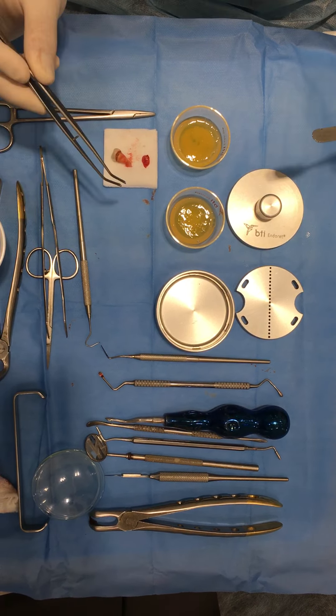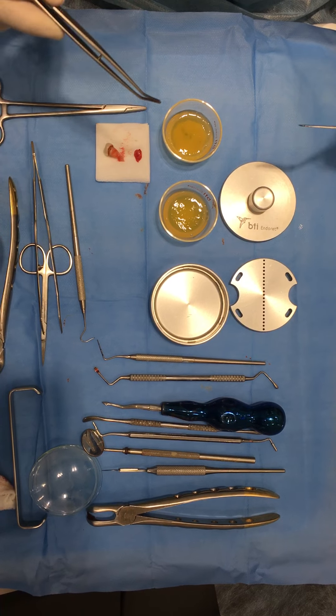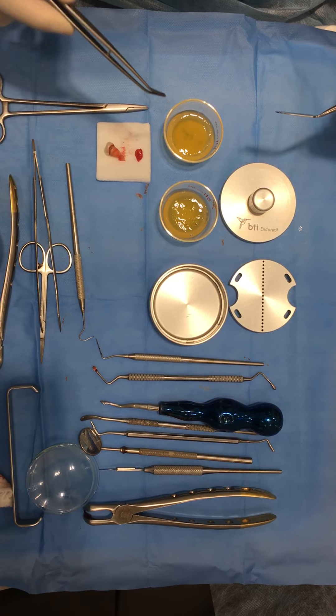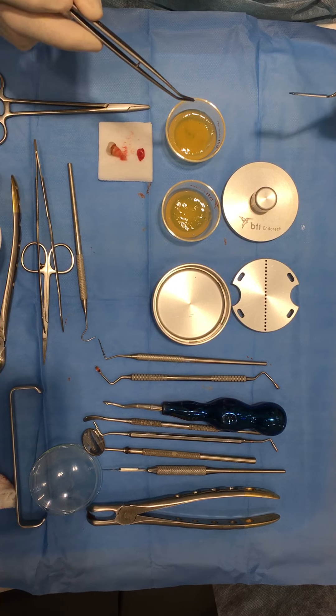Once we do this, we're going to perform a socket preservation technique using biomaterial. In this case, we're using beta-tricalcium phosphate — a synthetic bone that we mix with fraction 2.